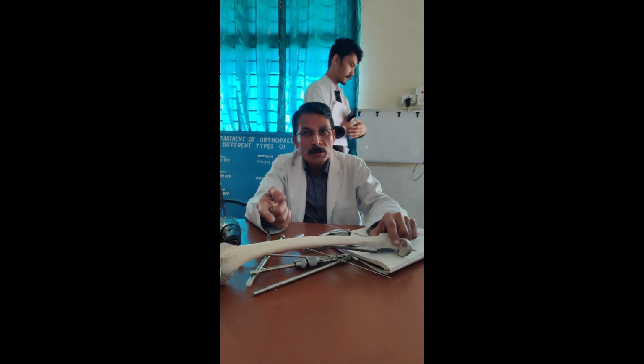Next is the analysis of the X-ray with the TAD. This is very important. If your TAD is less than 25, this is a good sign. That means I am in the correct position. How much you can allow the patient to move after operation depends on many things. Sometimes you can allow the patient full weight bearing. Sometimes you do not. So it is not a universal thing.